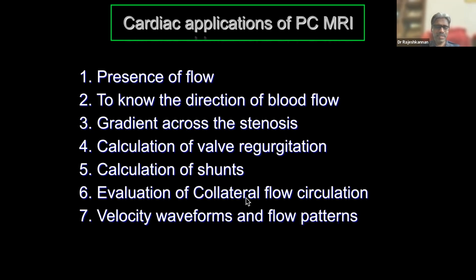For example, in the case of coarctation of aorta, just by looking at the collateral flow, we can quantify the severity of the coarctation. Also, we have to look at the waveform.